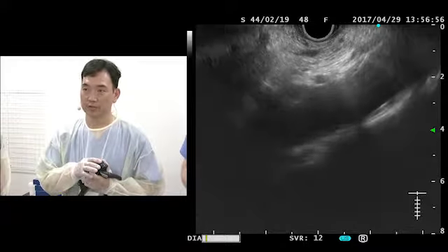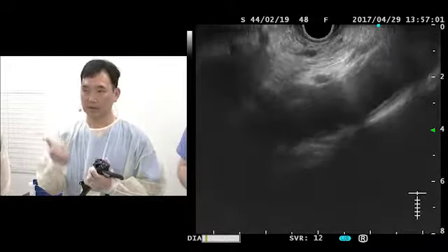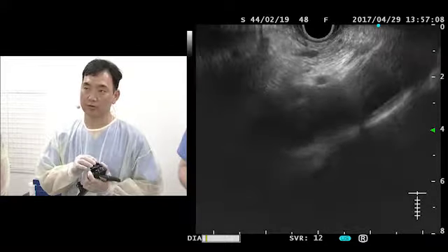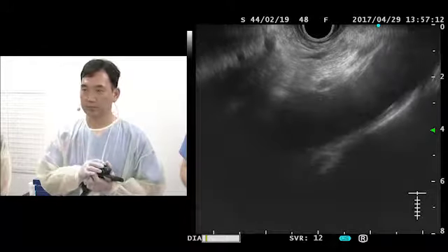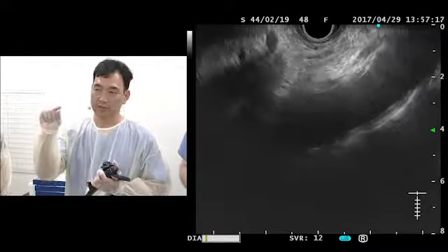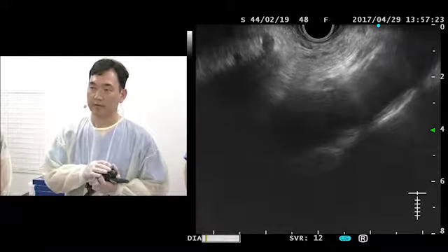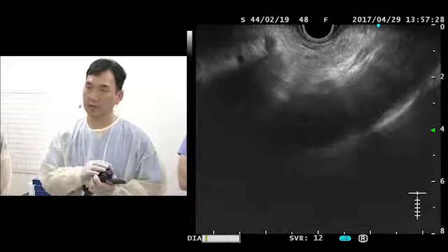As you saw in the imaging studies, the bile duct was dilated, the pancreas duct was dilated, almost mimicking a double duct sign. So it's concerning for a tumor in the pancreas head. But MRCP showed a rather narrowed distal bile duct. It's much more smooth tapering, and spontaneous normalization of liver enzymes can potentially suggest this may be a benign process.